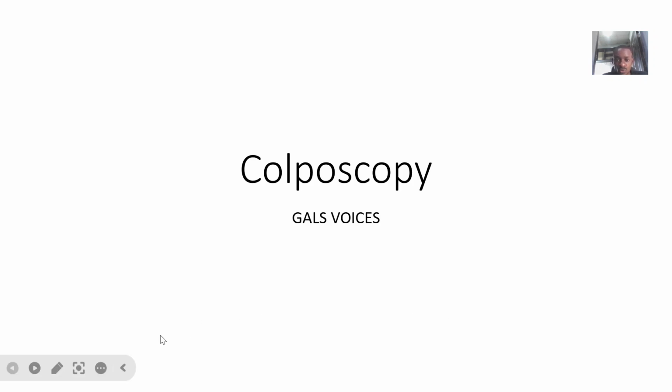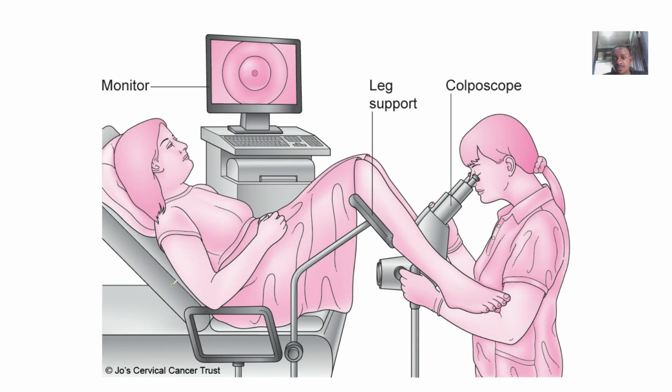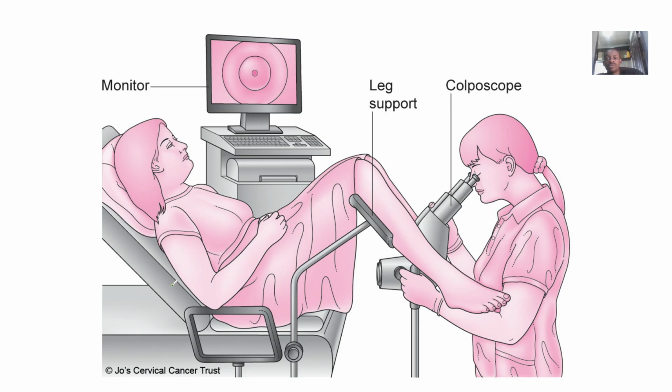Right. So looking at the next diagnostic procedure. Okay. So this is what is known as colposcopy. Right. So colposcopy is like a diagnostic method, right? So it's usually done using a colposcope.